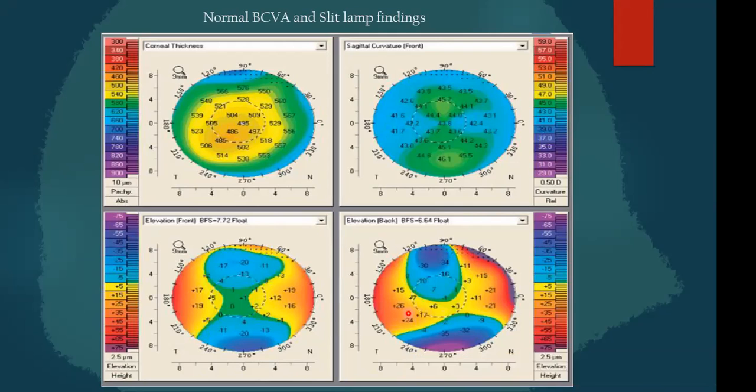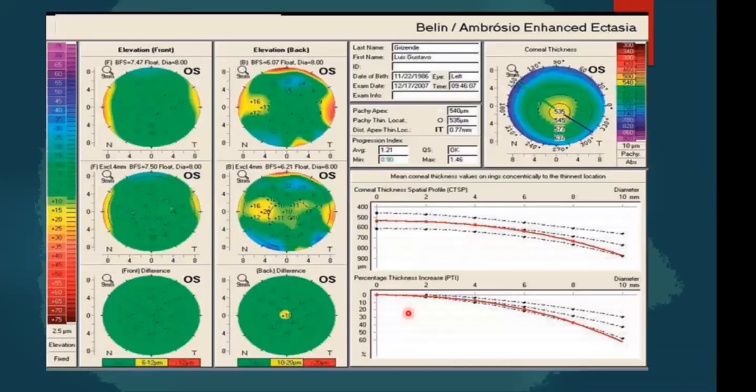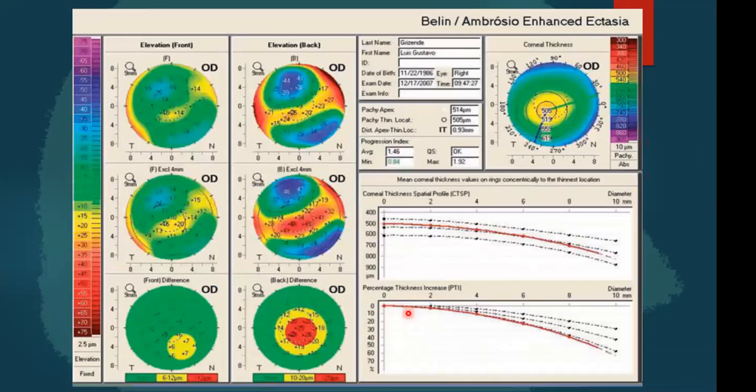Okay, so coming to the other things about the Pentacam, which is the Belin-Ambrosio enhanced ectasia display. Let's talk about this.